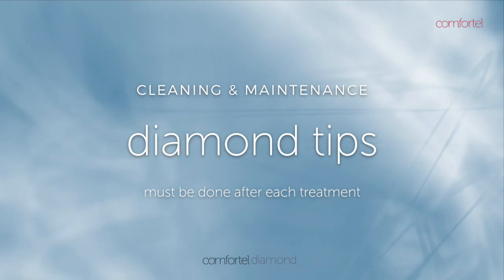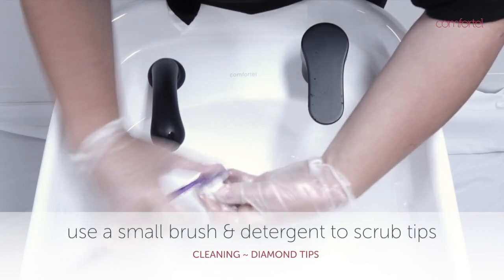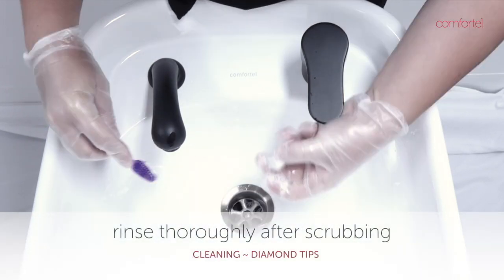Cleaning the tips after each use: scrub with detergent, a small brush, and warm running water to remove any skin debris. Rinse thoroughly to remove residue.